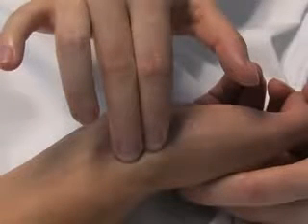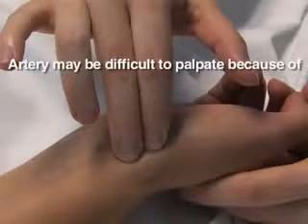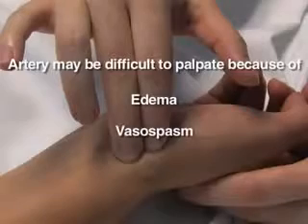The artery may be difficult to palpate, for example, in the presence of overlying edema or vasospasm. A portable Doppler ultrasound device may be used to identify the location of the radial artery in these instances.